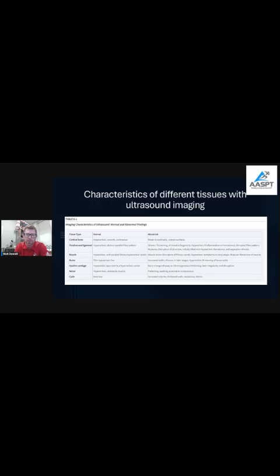If the fibers are disrupted at all, that suggests some type of tear. Sometimes you'll see calcium deposits within the tendon as well. And it's rare that I'll have these, but a complete disruption of the fiber types. You can usually see that with your exam, but this would help rule it in with ultrasound imaging.